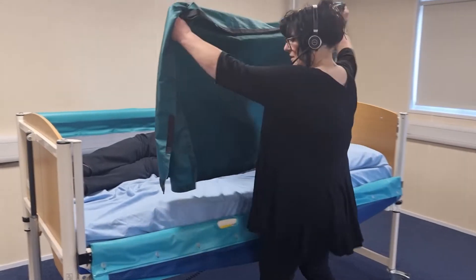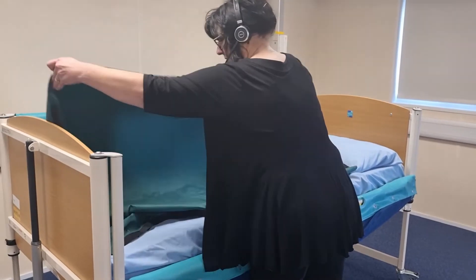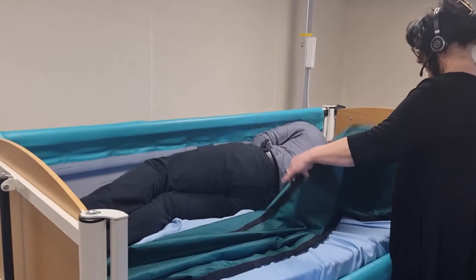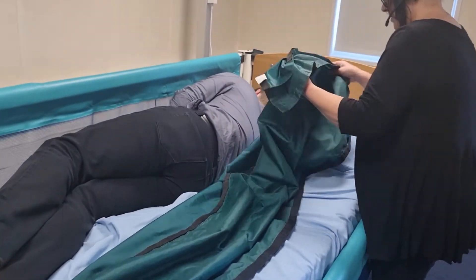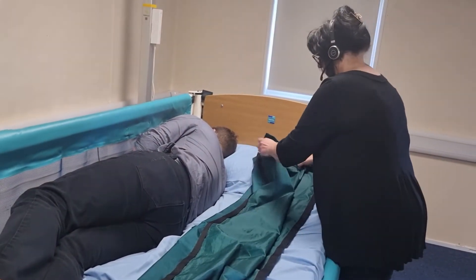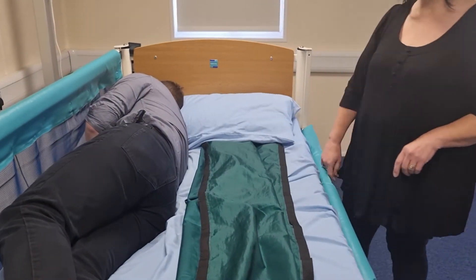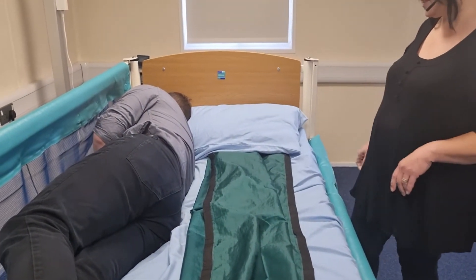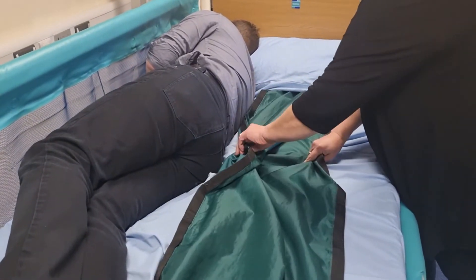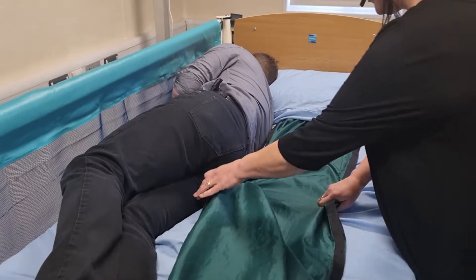The tips for fitting slide sheets are to be neat. If you position your slide sheets on the bed neatly, you can fit a slide sheet under the pillow and that will protect the person's head and hair. Then what we do is we just fit the slide sheets underneath the person.